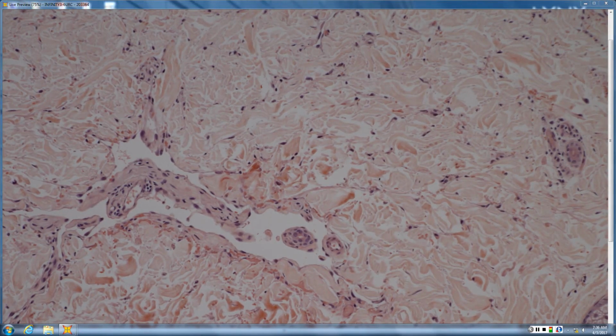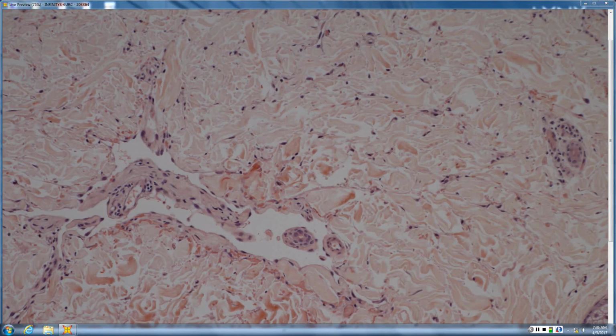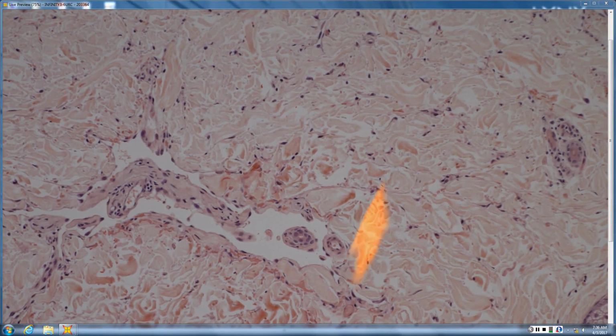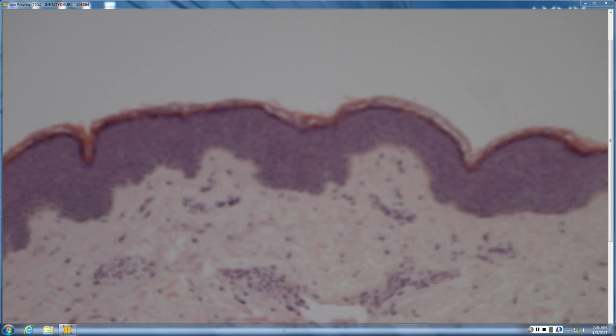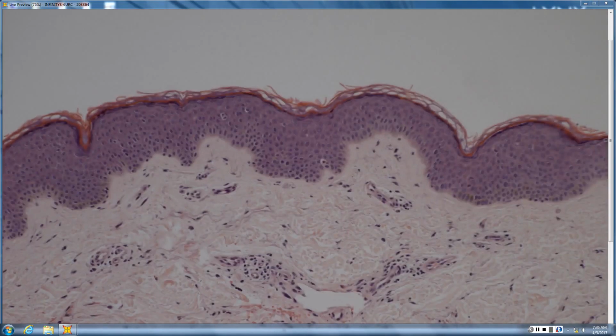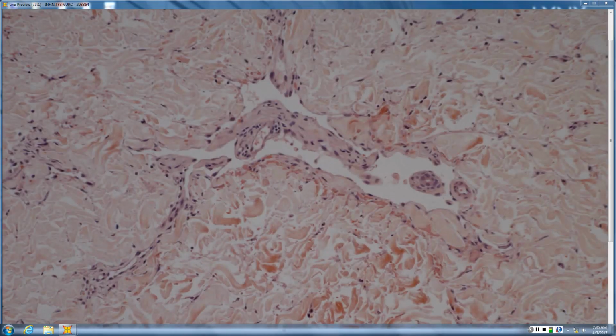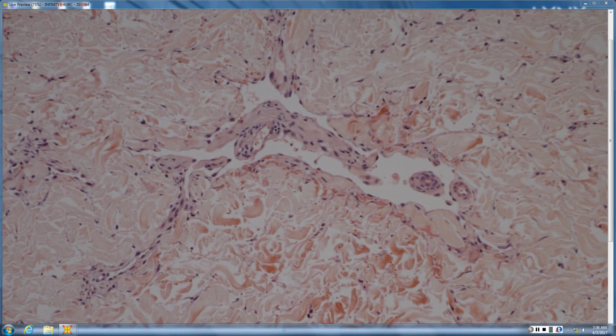Vascular spaces that are high and irregular can mimic lymphangioma, sort of like this one here, kind of off the screen for those online. So up top here looks like lymphangioma, and then down below looks like Kaposi's, but it's HHV8 negative and is an important simulant of Kaposi's. Well done.